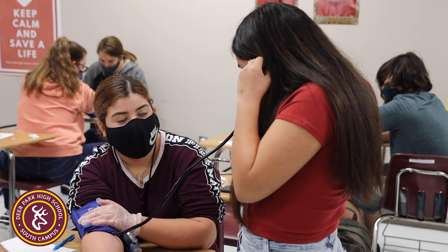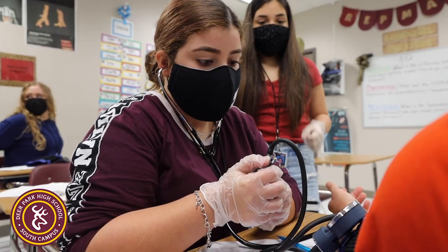The students are learning how to use the stethoscope and the blood pressure cuff, learning how to operate it and how to effectively check for blood pressure.